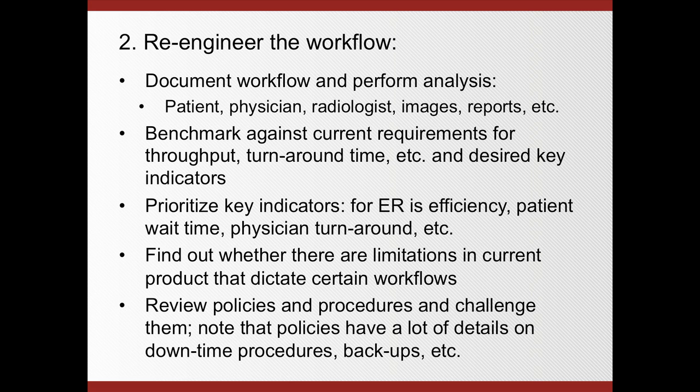And then when you look at the workflow, you analyze it not only from a patient perspective, to find out what all the steps are that a patient has to go through, but also from a physician and radiologist perspective as well. And then you also want to look independently at the stream of all the images and the related information, as well as the reports. So you actually have different workflows. And then you might want to optimize it depending on your requirements.